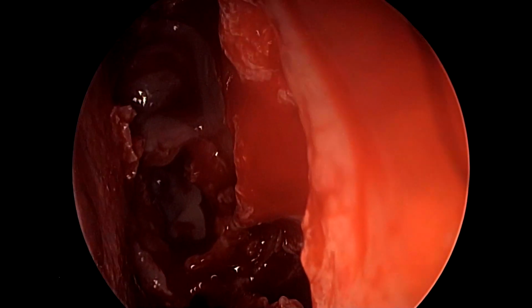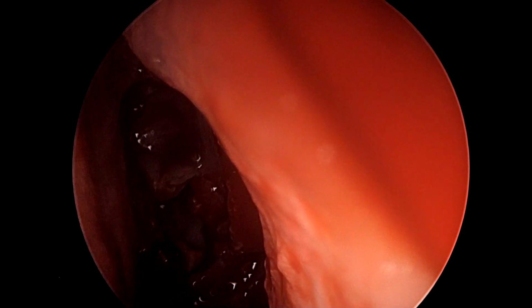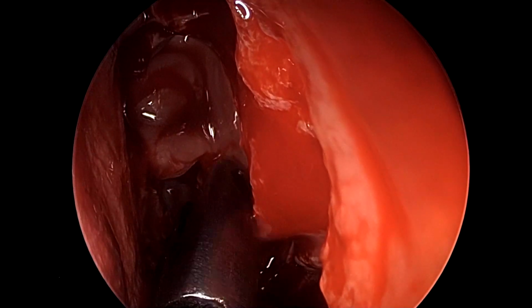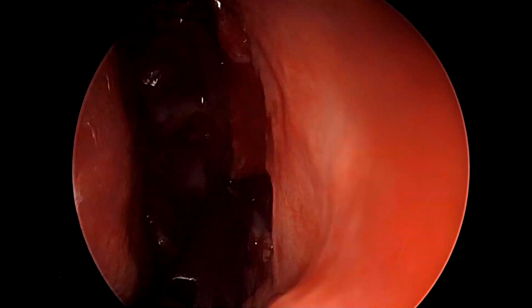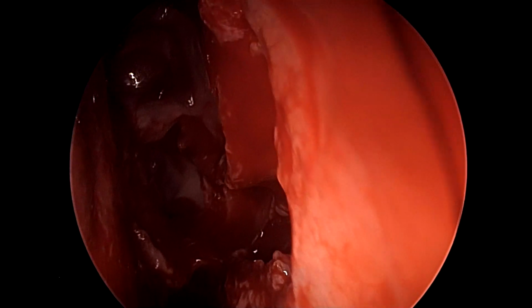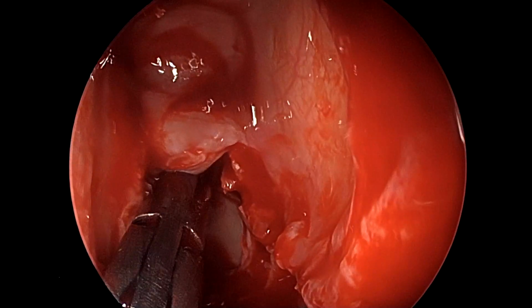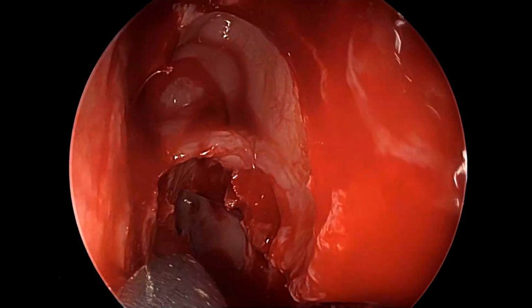So once again, we prefer to use our cold instruments or Blakesley forceps to remove bony chips, and prefer to use the shaver on the excess redundant mucosa while maintaining a distance from the meningocele. In case the excess mucosa is very close to the meningocele or is practically in contact with it, then we would recommend to not use the shaver, and in that situation shift to the coagulator, because the shaver would eventually inadvertently puncture it and create potential problems.